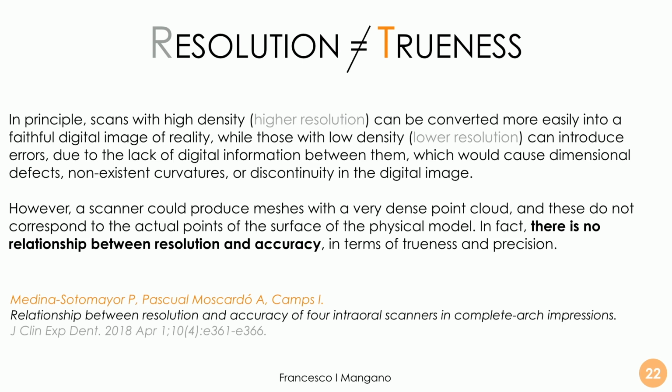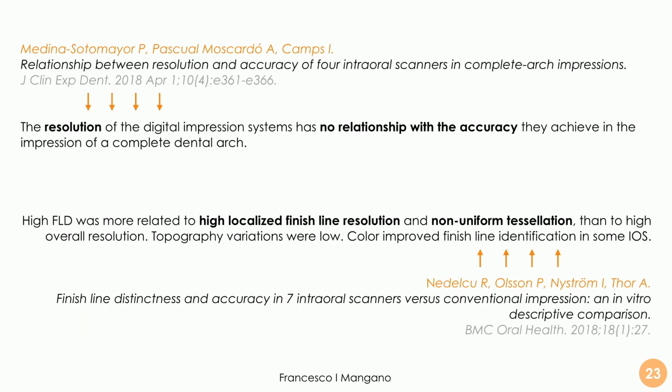A lot of studies have been published recently, and from my experience also I can tell you that for some implant applications, for example, there's no need to have such a high resolution. The most important thing is the trueness, because trueness is even more important. And a lot of papers basically found that there is no relationship between the accuracy of a model and the resolution of the model itself.